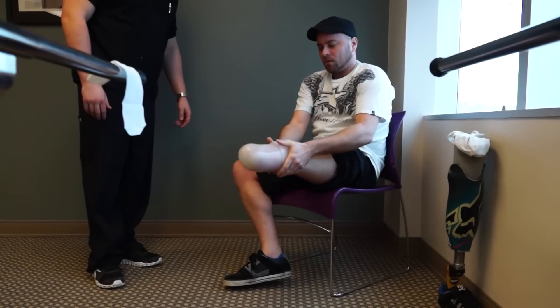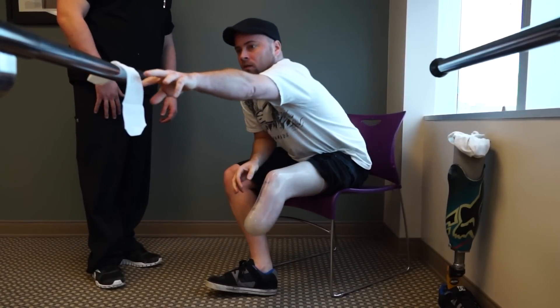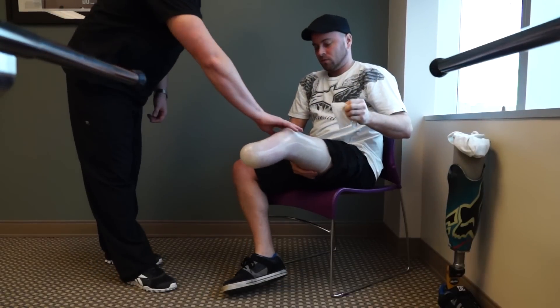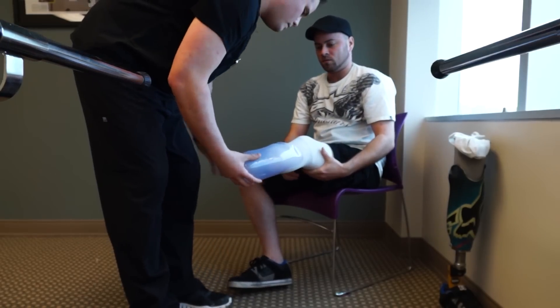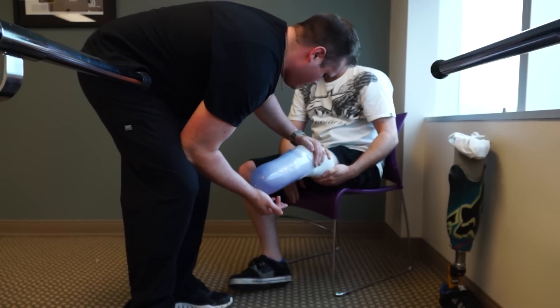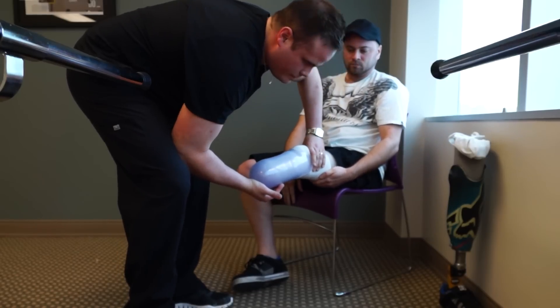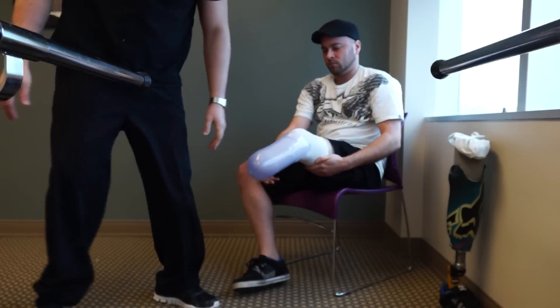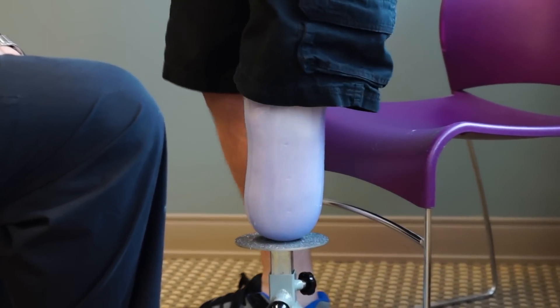Jared is going to be using a suction socket where previously he used a pinlock. The process of fitting a check socket for a running leg is very similar to that of a walking leg, and in fact two identical sockets will be made — one for Jared's running leg and one to replace his walking leg — so that the same socket and system are being used for both running and walking.